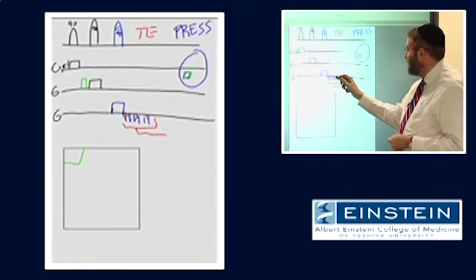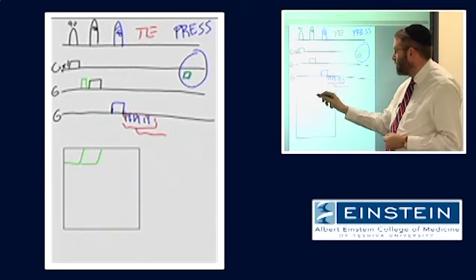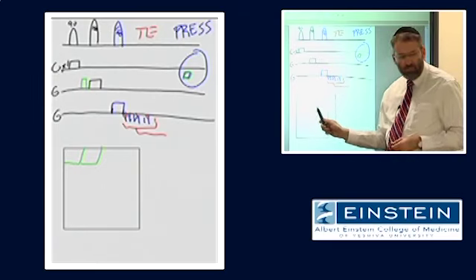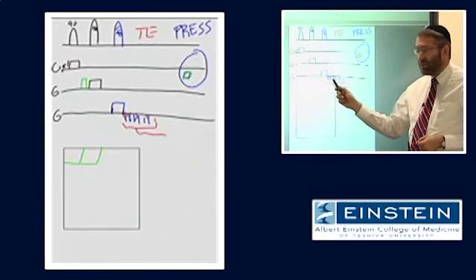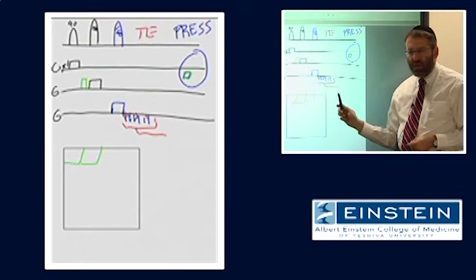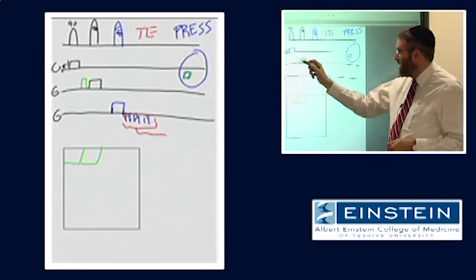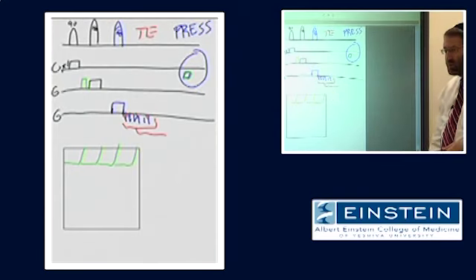And then whatever we sample, we can place over here. These differ by what? By the fact that there is a phase difference. For every single one of these samples, there is a phase difference between the two of them. Now notice that no gradient magnetic fields are on during the time that we sample the signal. And I can do this again and again with different iterations, with different strengths of this gradient magnetic field.